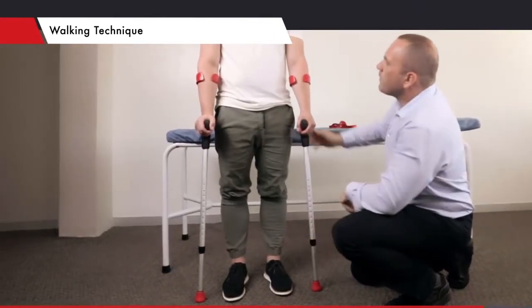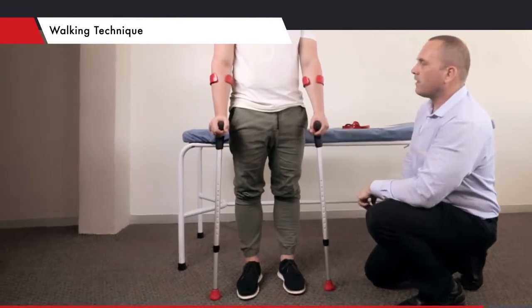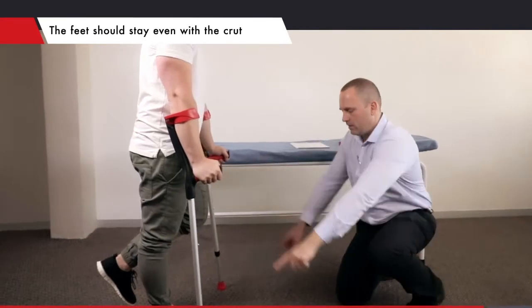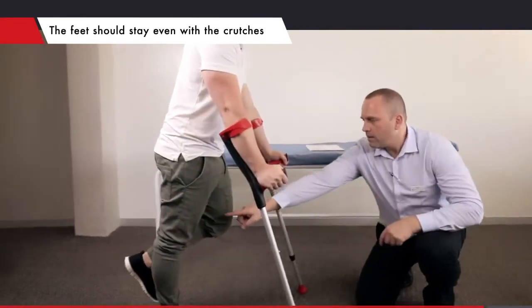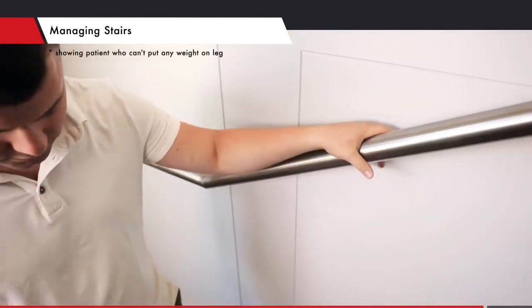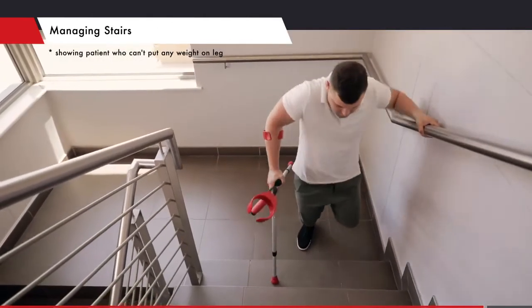Ask the patient to squeeze the crutches between their upper arms and their ribs, then take the weight through their hands. The patient should first move the crutches forward, then move the sore leg forward. Then they should take the rest of their weight with their hands and arms, then step past with the stronger leg.